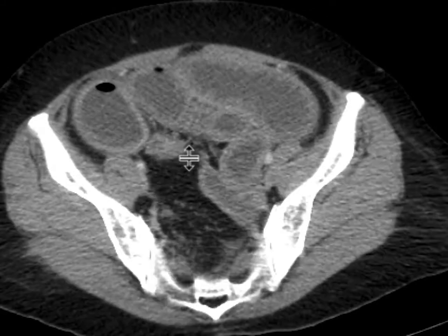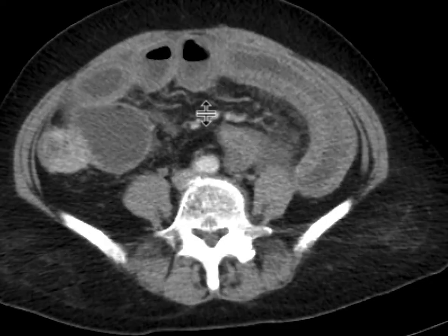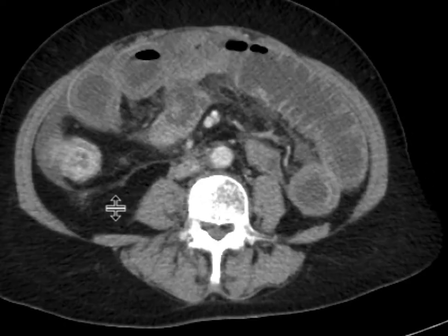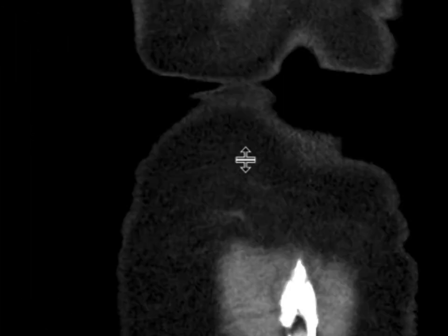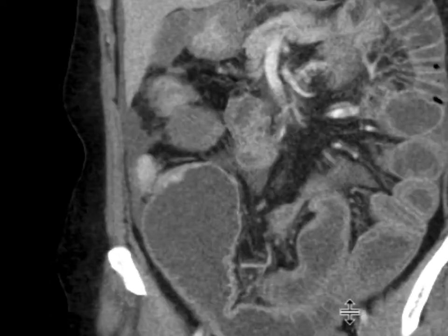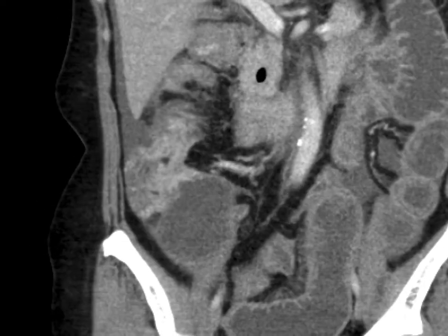We can follow these down to the ileum, and specifically the terminal ileum, where we can see this hyper-enhancing mass really centered at the terminal ileum, extending a little bit into the cecum over here. We can see these findings very nicely depicted on the coronal image as well, right about over here.